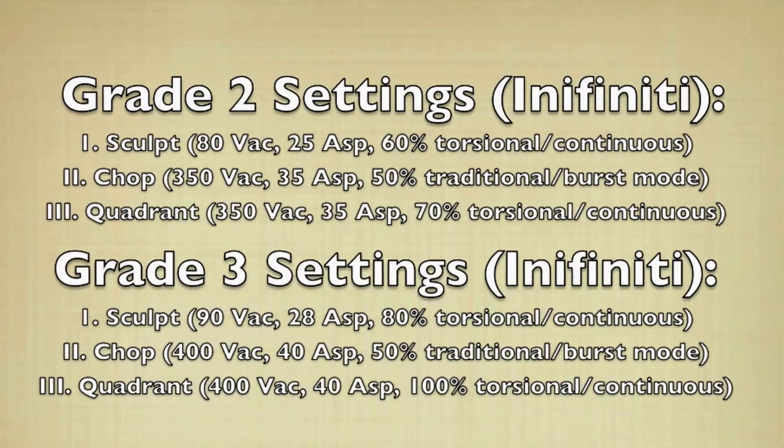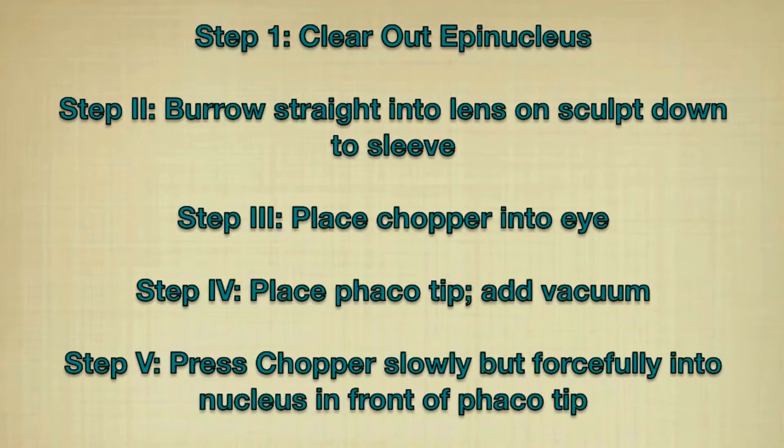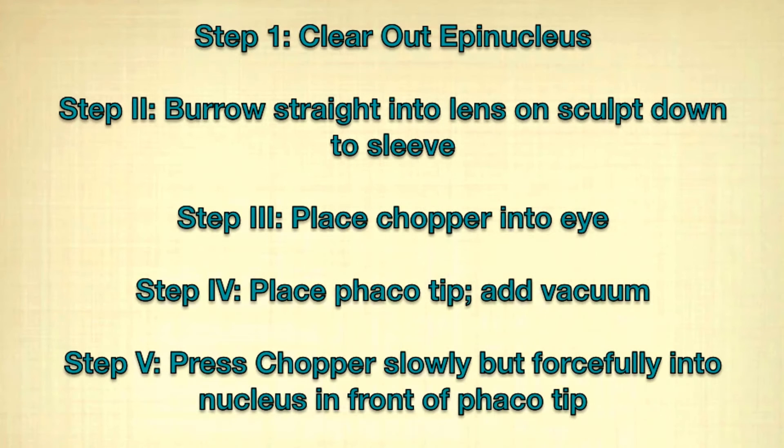I then use continuous ozel to emulsify the quadrants in the quadrant setting. If you haven't watched my horizontal chop video, I recommend watching that first as the same principles apply in terms of preparing the lens to make everything simple. I do this step by step. The only difference being that with a vertical chop case I will add vacuum and really get good purchase on the lens before beginning the initial chop, whereas the horizontal chopper is placed before adding vacuum.